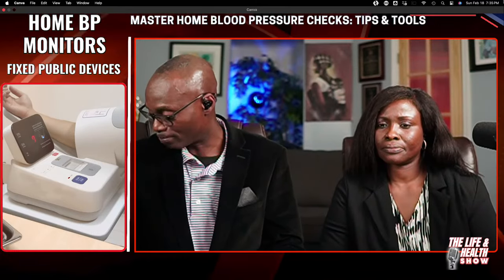But in the U.S., in some pharmacies at least, if you walk in there, you want to check your blood pressure, you can ask for the pharmacist, and a machine is usually outside right in front of the pharmacy. And you can sit in, push a button, and it's an automatic cuff. You put your hand in, and it will read your blood pressure if you follow the instructions. If you have any difficulty, you can ask your pharmacist for assistance, and they will be willing. This person here is being assisted by a pharmacist. They'll be willing to help you take your blood pressure. So you don't have any excuse.